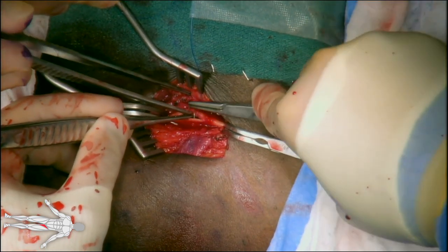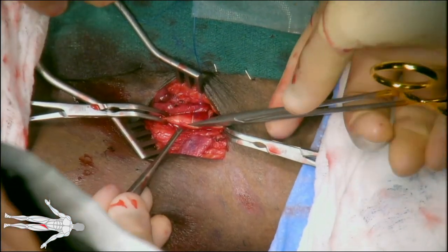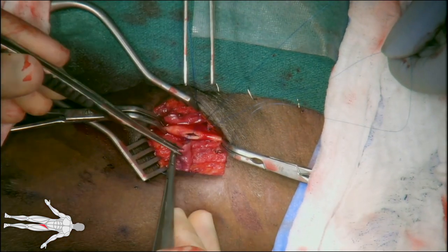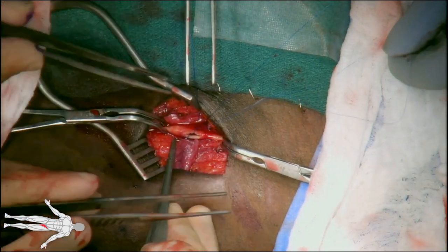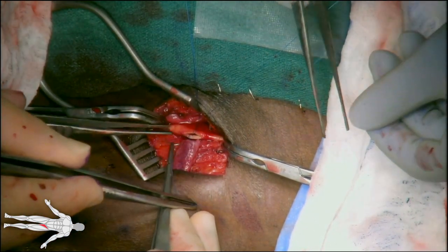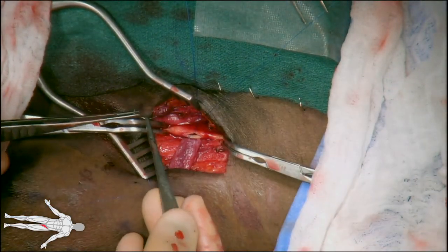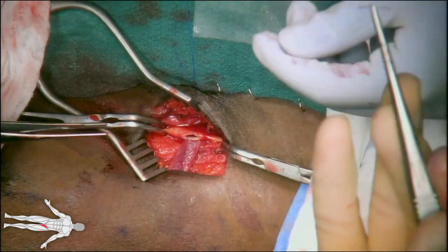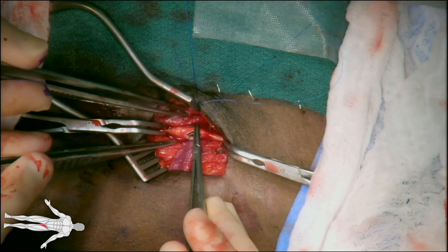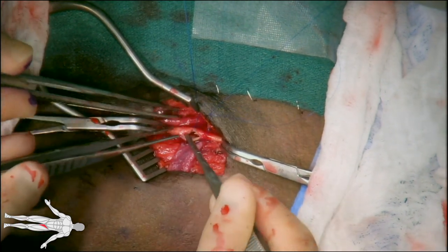Stay sutures allow for adequate exposure during construction of our anastomosis between the arterial graft and the common femoral artery. Next we proceed by creating an end-to-side anastomosis between the common femoral artery and the arterial graft.